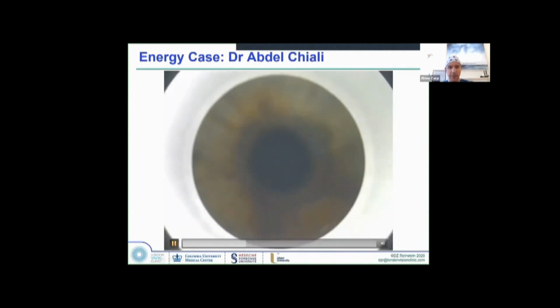He did create a new smile lenticle, and you'll see here, much better bubble pattern, although there is still a dark spot, and I'll cover that dark spot in a second. You can see the dark spots over here. So this is definitely meibomian oil, which is masking the ablation. But creating the lenticle at exactly the same depth, he was able to remove this lenticle, and fortunately there were no slithers, and got a very good visual outcome.